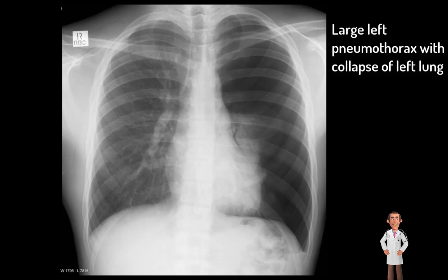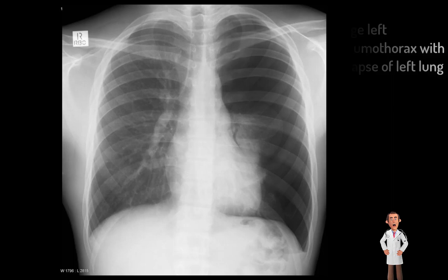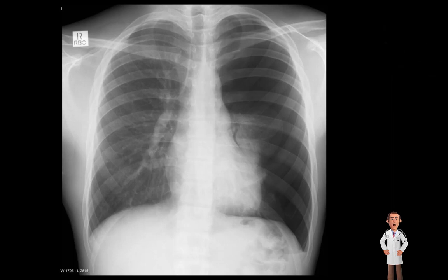There is no evidence of tension in this spontaneous pneumothorax. Management in this case would involve resuscitation, followed by insertion of an intercostal chest drain, and then re-imaging to assess resolution of the pneumothorax.